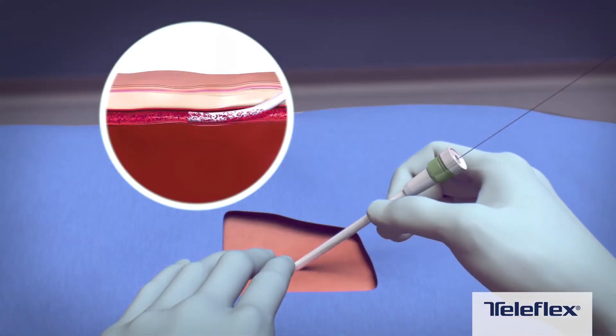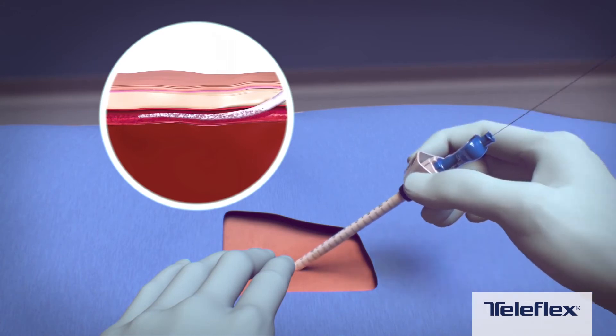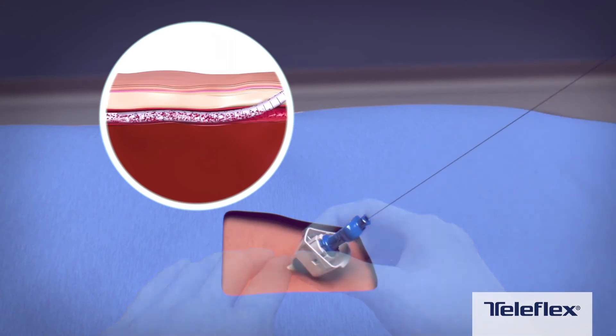After the large-bore procedure is completed, closure begins by exchanging the procedural sheath for the Manta sheath over the guide wire. Fully insert the Manta sheath into the vessel and remove the introducer.